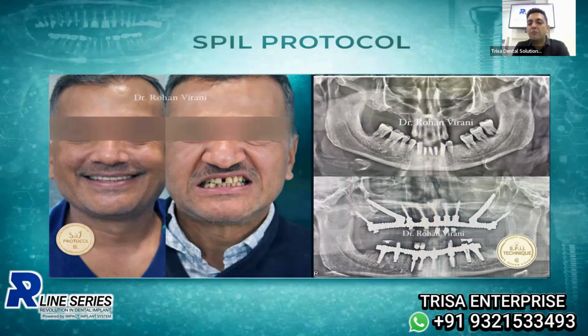In the mandible, things get even crazier because as you see in the anterior zone, where you see my cursor over here, you see the KOS MU implant. You see this KOS MU implant in the anterior maxilla. You see the BCS MU in the anterior mandible, and posteriorly the two-piece conventional implants, which means you are seeing one of the craziest cases wherein a two-piece zygomatic implant is amalgamated with the BCS MU implant in the lower jaw, amalgamation of KOS MU single piece, BCS MU, and posteriorly the two-piece DSI implants, all creating retrievable prosthesis, 1 or 2 drill protocol.